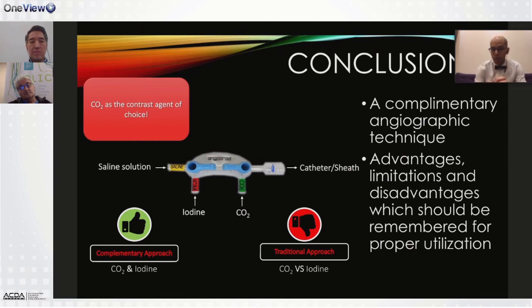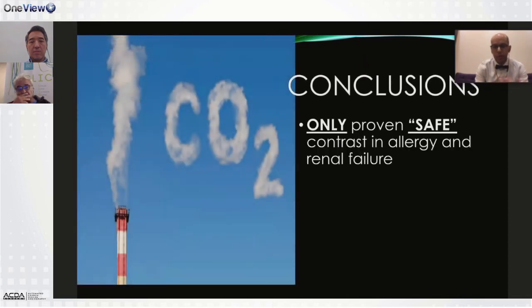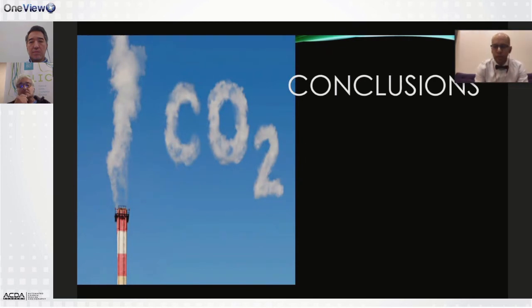Has nothing to do pretty much with having a machine or not. If you know how to use it, you know how to connect it, you know how to prevent an air contamination, then you're good to go. The machine will make your life easier, make your images better, make your patients probably more comfortable, but it's not an essential. It is important, and we use it essentially, but you can still use it without it. CO2 is the only safe contrast agent. My 2 cents about CO2.